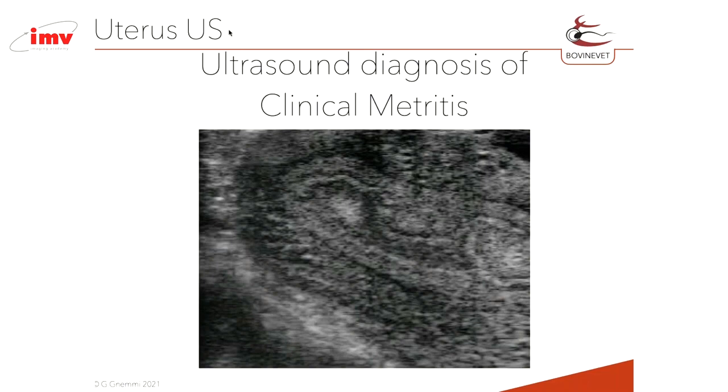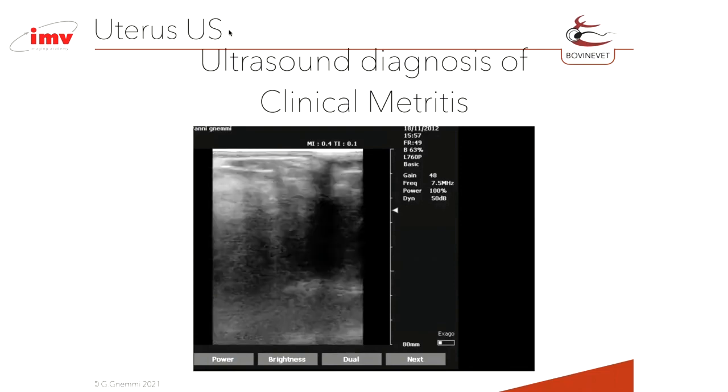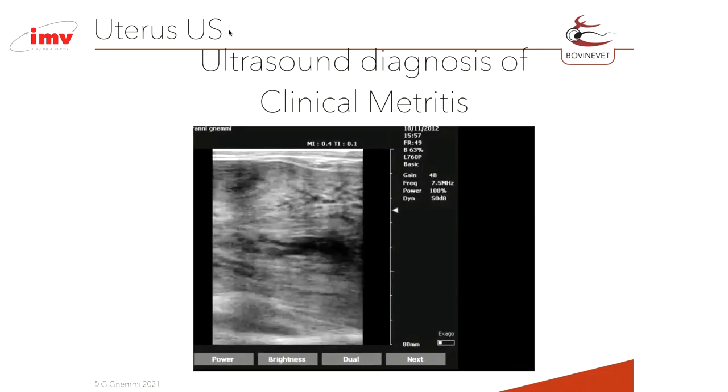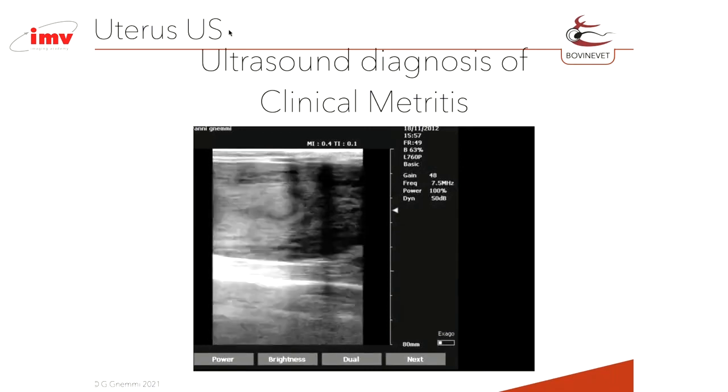I use this type of exam, ultrasound, also to evaluate the presence of corpus luteum. In regular cows, normally between day 7 and 8 after delivery, we have the first recruitment, and normally we have the first ovulation, in 99% of the cases without estrus signs, around day 13 to 15, because there is the ovulation of the dominant follicle of the first follicular wave. Well, another interesting thing is that often, checking the cows at this moment, over the cotyledons we can find a hyperechoic stripe.